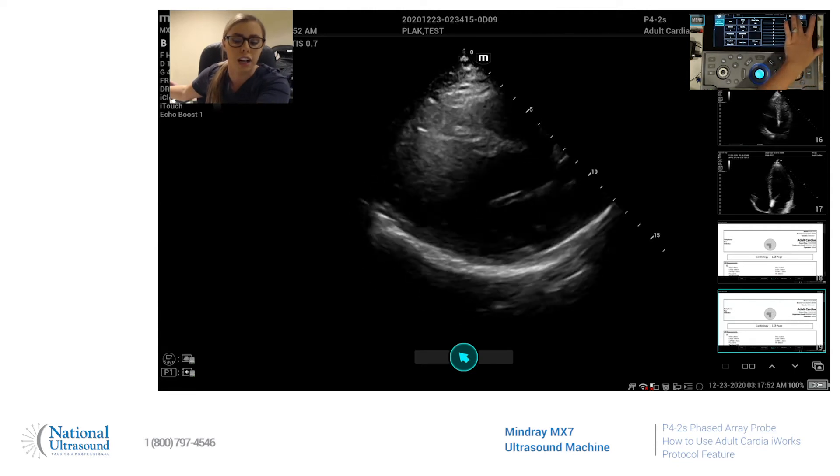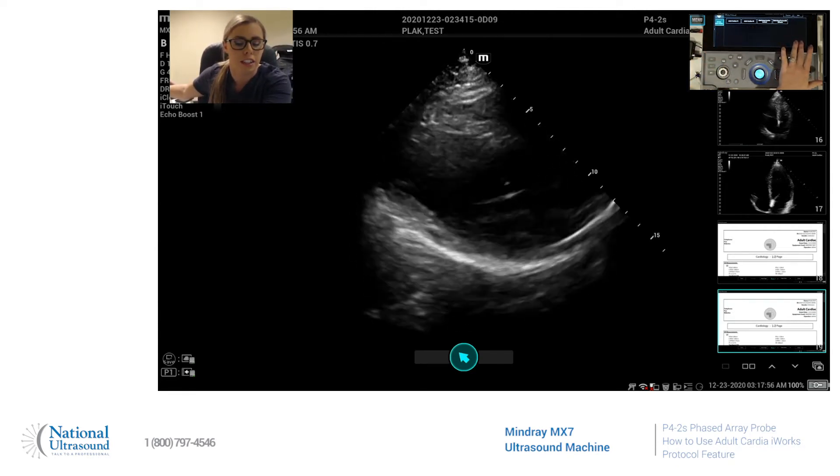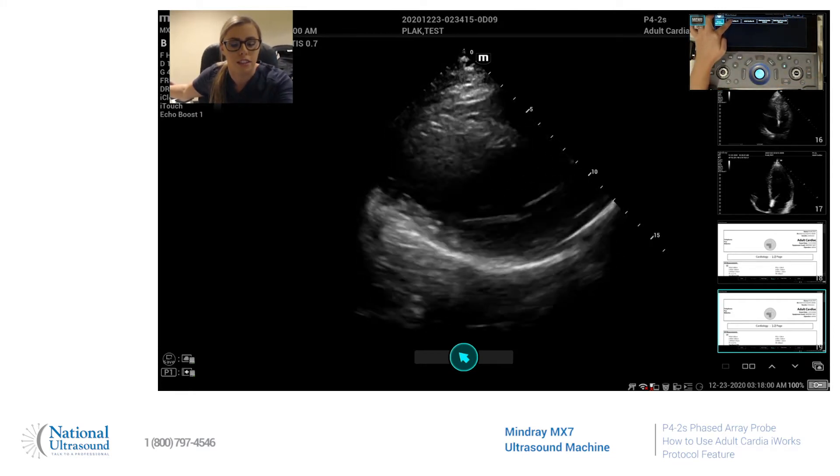First you will click your iWorks button. You can choose from the protocol that is already on here or you can make your own. We're going to use adult cardiac one today.